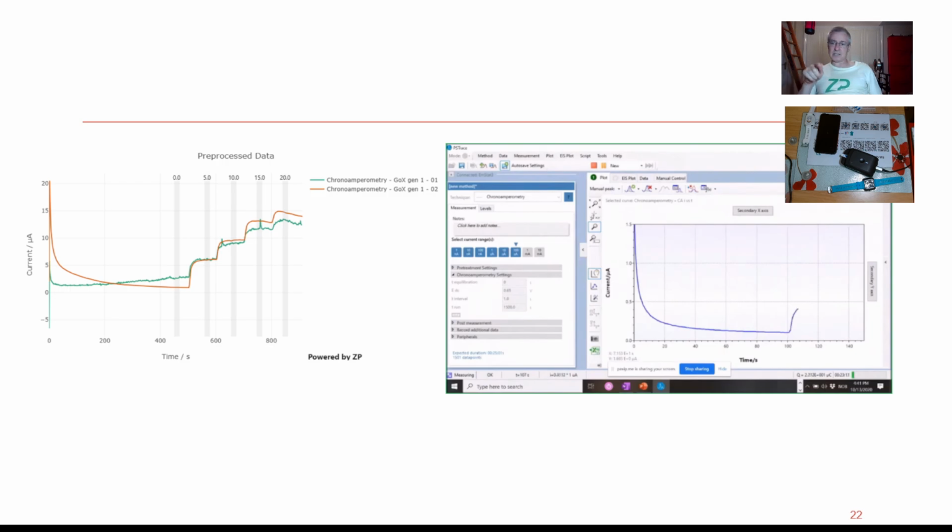You need to get to this position on something like our planar CGM sensors before you actually start troubleshooting those microneedles. I've got a suspicion that they're doing electrochemistry other than just glucose. So Andre lets this run, and then he just adds in a bit more glucose just here. He just pipettes it in. I'll give you a link to this video as well.